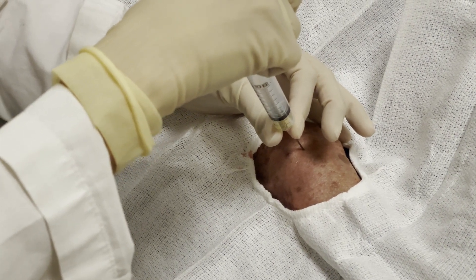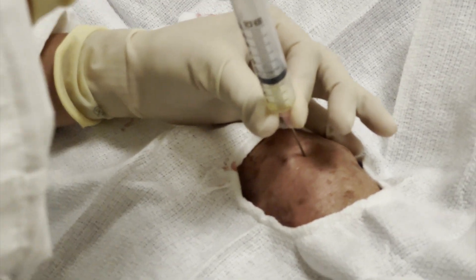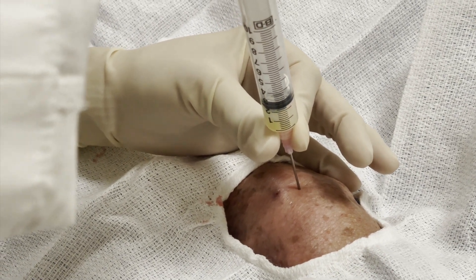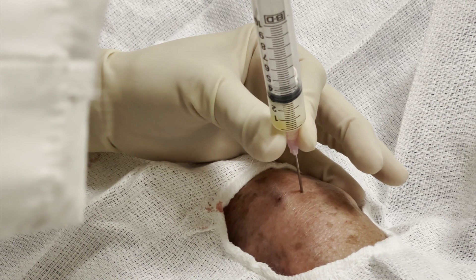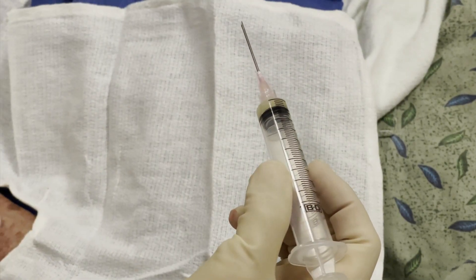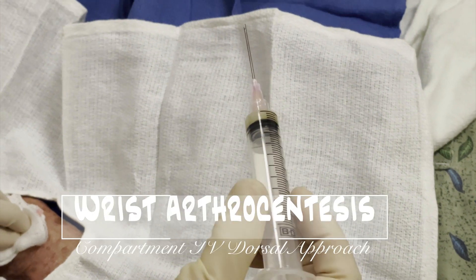And there you go — voila! Quite satisfying to see fluid come up through the syringe on my first try. It stopped flowing, so I got a total of about a cc of yellowish creamy fluid. And that's it. Hope that this is helpful for you. That was sent off to the lab.